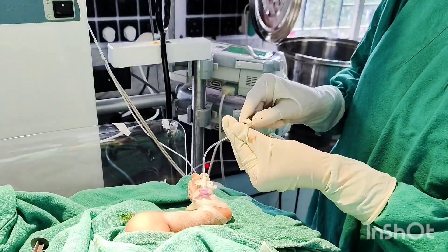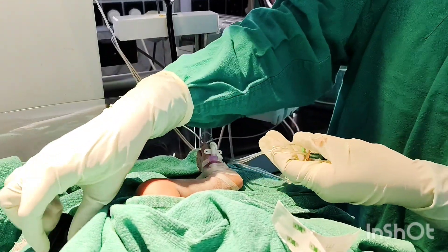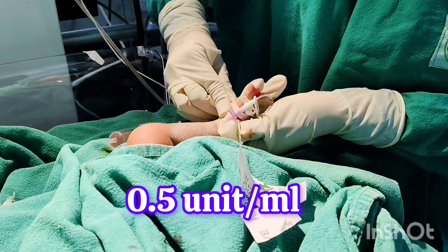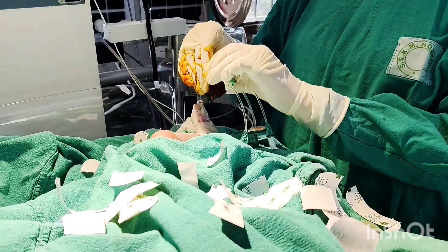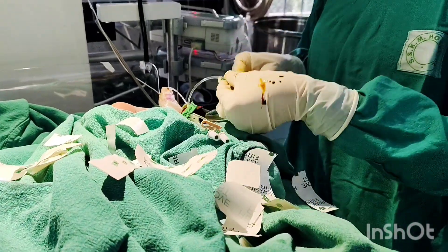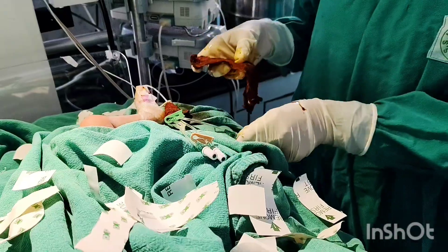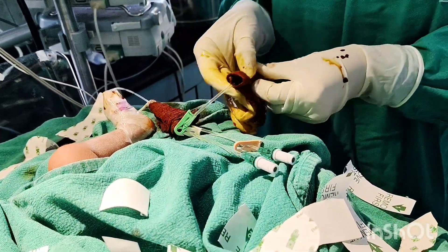Heparin should be added to all fluids being infused through the PICC line at an amount of 0.5 units per milliliter of intravenous fluid. All extension line connections are wrapped with betadine-soaked gauze to prevent infection via the PICC line.